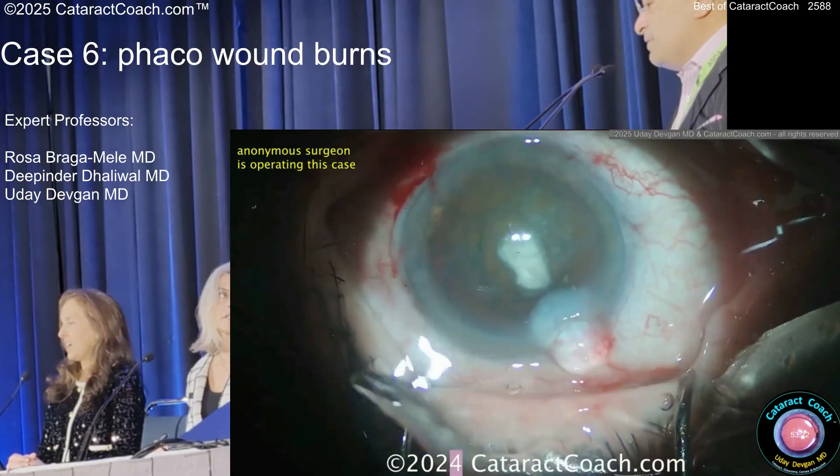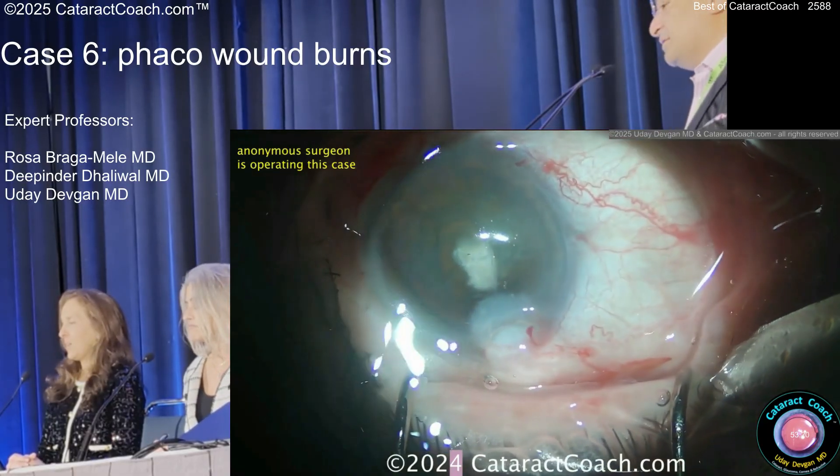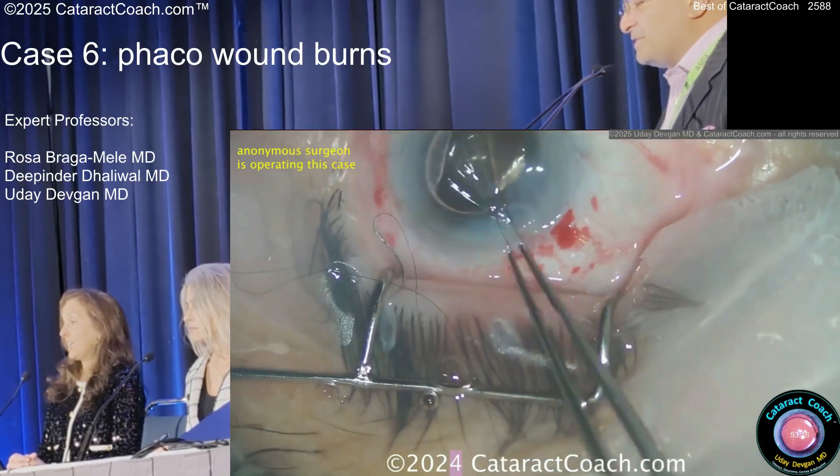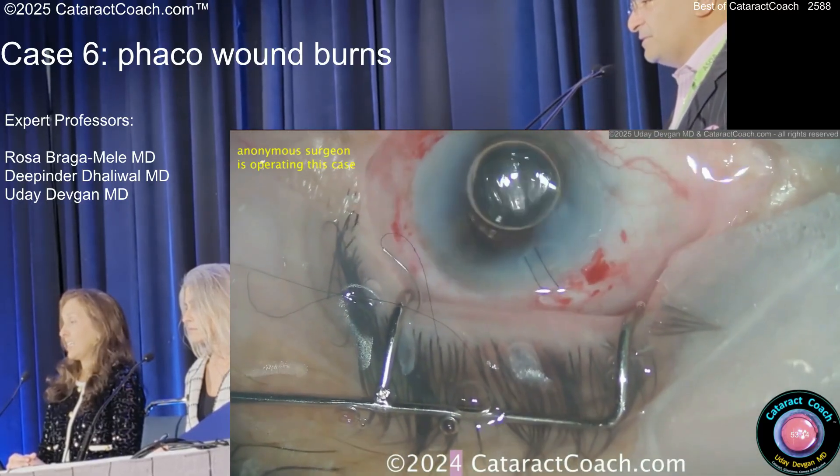That's probably viscoelastic — the tip is blocked for sure. That's the key issue. And then the surgeon's going to suture this up. There's a lifetime of irregular astigmatism for you. Enjoy that.